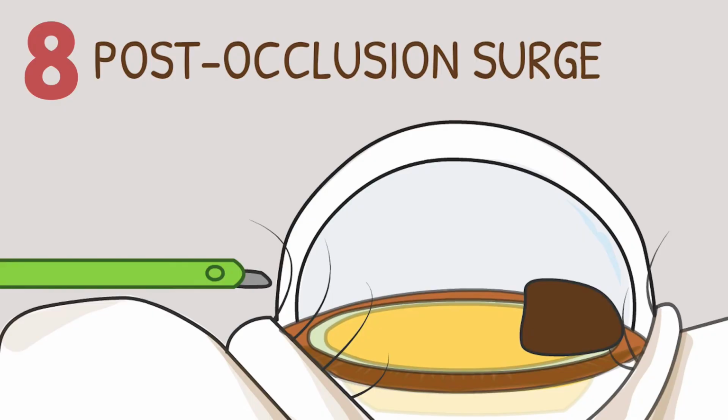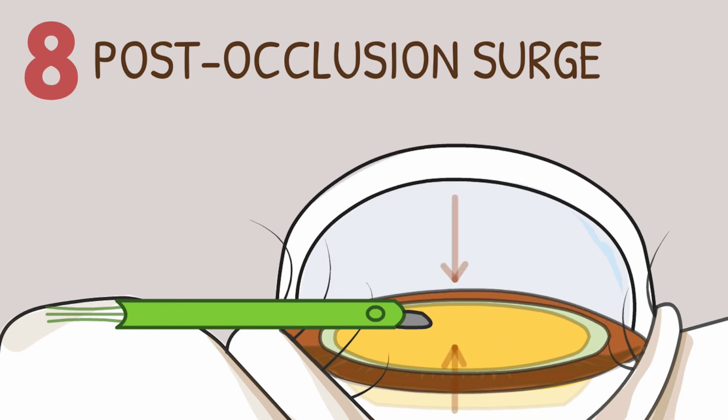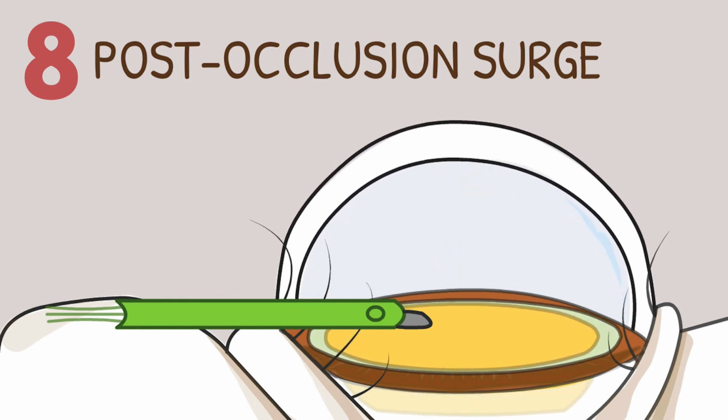Post-occlusion surge. This is very dangerous. I made this cartoon just to show you the surge and the risk of PCR during surge, because the bag will come toward the phaco handpiece and also result in endothelial damage. Please note the sudden collapse of the AC and momentary pupillary constriction.